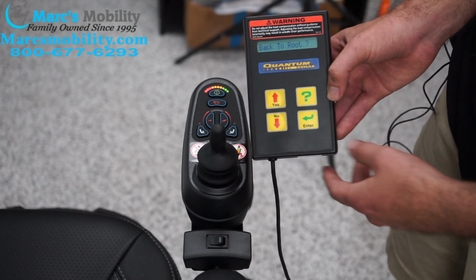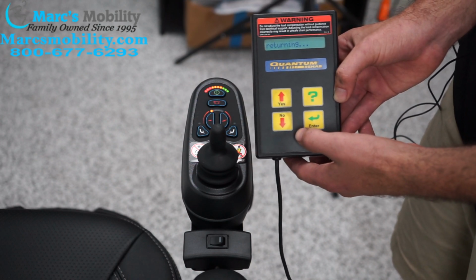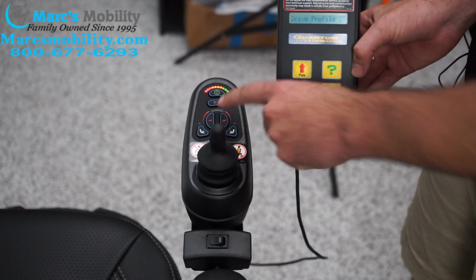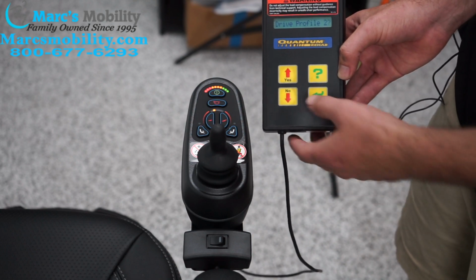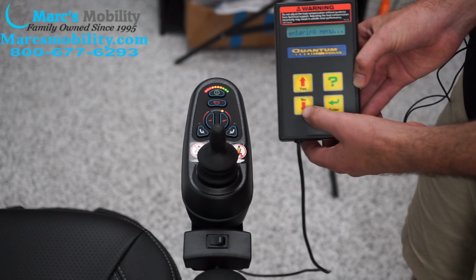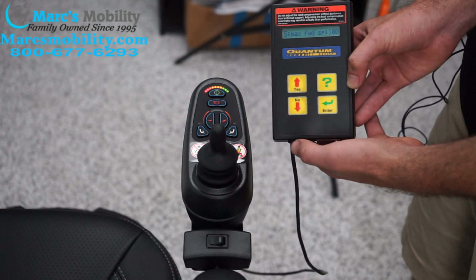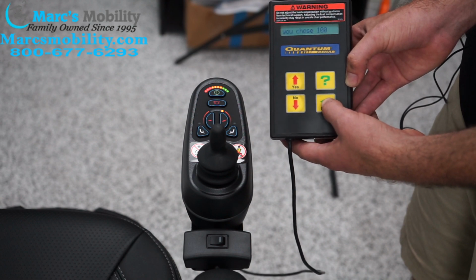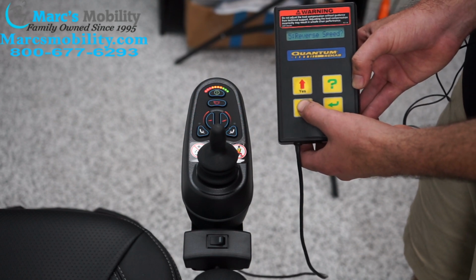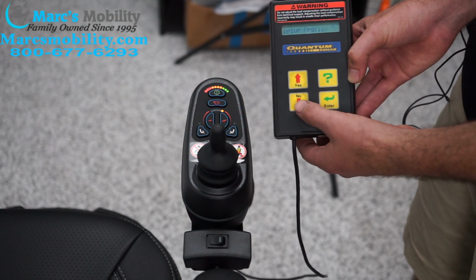Now we get to this screen that says back to root. This will take us back to the main menu when I hit enter. Here we are at drive profile 1. Now if I want to edit the second profile, which is your second dot, I can do that. All of these are independent. 3, 4, and 5. So 5 is your fastest speed. Just for fun, we're going to take a look at it. The forward speed is set to 100. That's the fastest this chair can go, about 4.5 miles an hour. Minimum is set to 40. So I'm going to go back to root and go through some of the other options in the programmer.